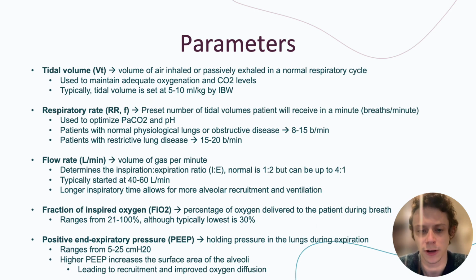Next we're going to be going over some of the parameters that are commonly seen with mechanical ventilation. These are typically going to be seen in some of the order sets, and in fact at the very end of this presentation I'll go over some example orders. So it'll be good to memorize and learn what these actually mean, because they're also important in the different modes. So to start, you have your basic tidal volume.